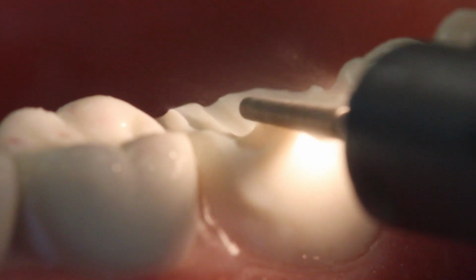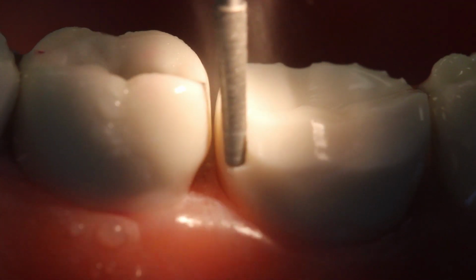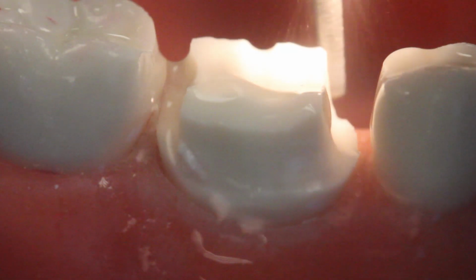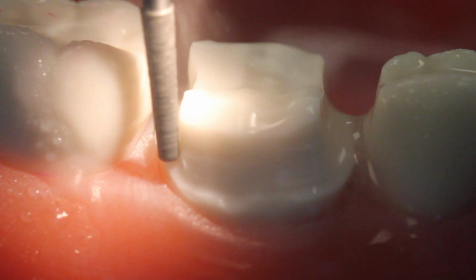The first step in making a crown is to grind down the tooth, and we'll call this preparing the tooth for a crown. You'll take a diamond burr and start to grind away some of the surfaces that are on the top, which is the occlusal surface, as well as circumferentially around the tooth.